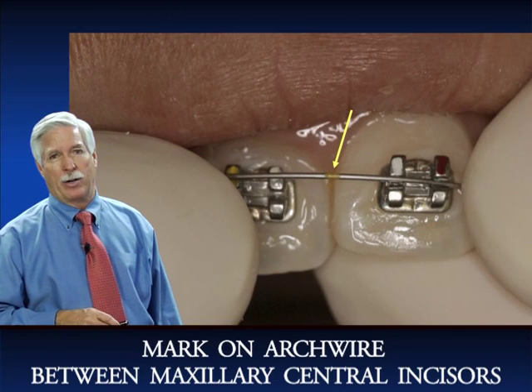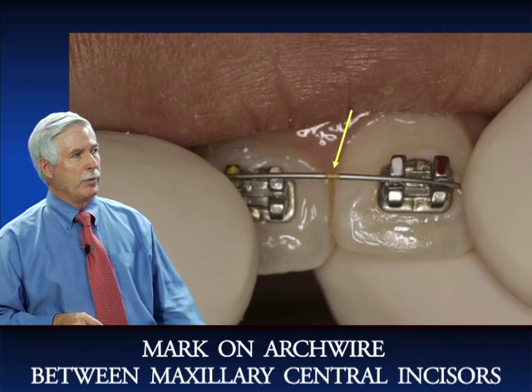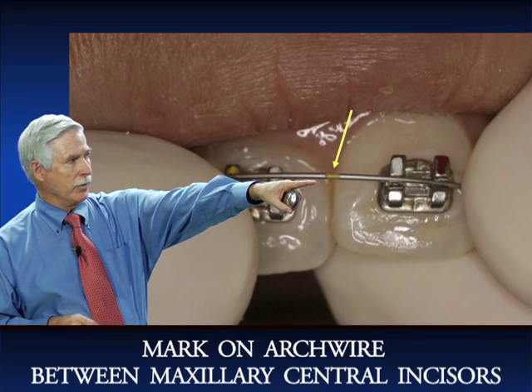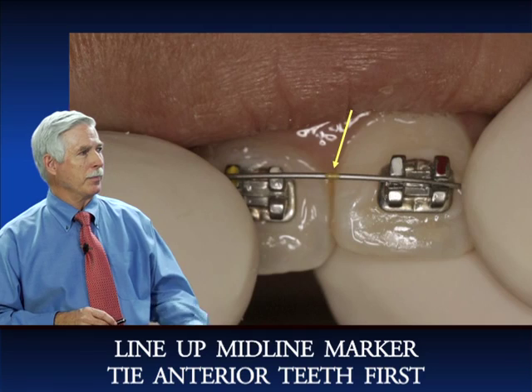Now we always have a mark on the archwire. There's a yellow mark on the upper archwire that goes right between the two central incisors. So you want to put that yellow mark right between the two central incisors. And we kind of put the anterior teeth in first.